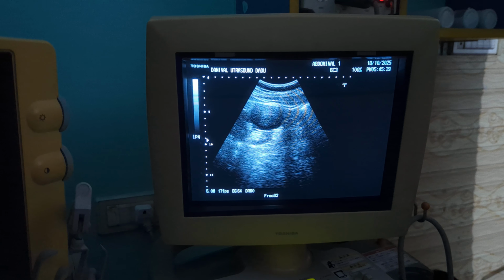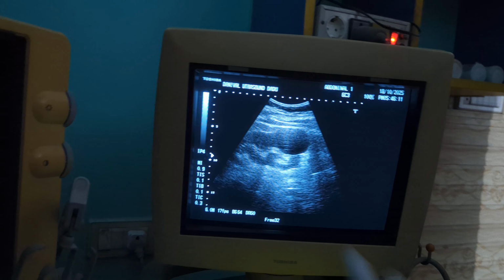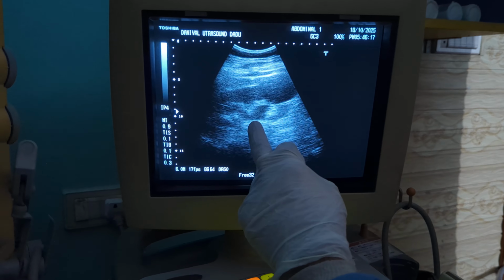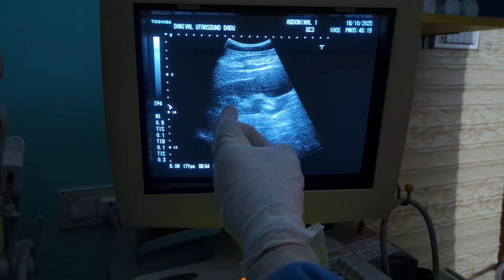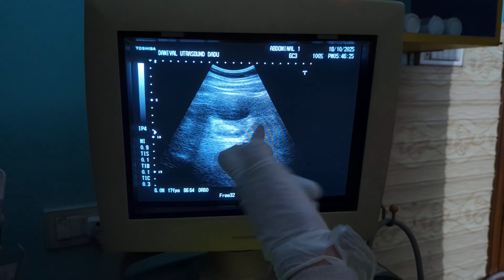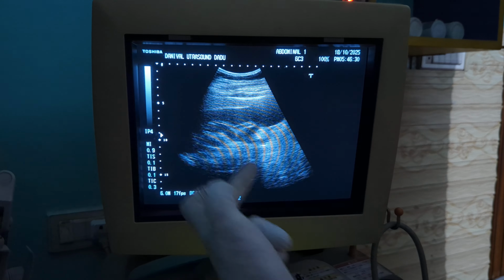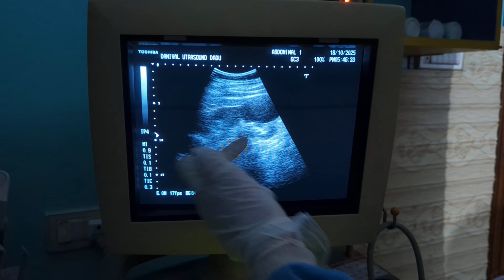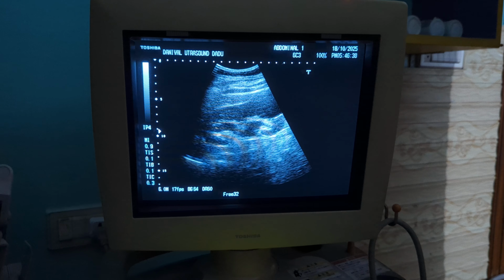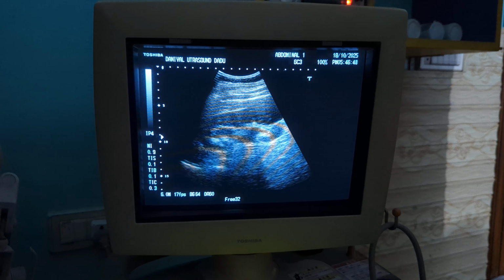Now hydronephrosis, another important point is that these cystic areas look connected to each other in hydronephrosis. They are connected to each other, whereas in cysts, there is no communication with the pelvicalyceal system. They are connected in the hydronephrosis, and they lead us to the pelvic area, as I told you earlier. But cysts do not show any communication, neither do they take us to the pelvic area.